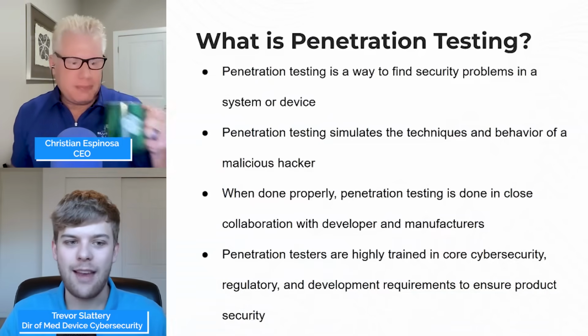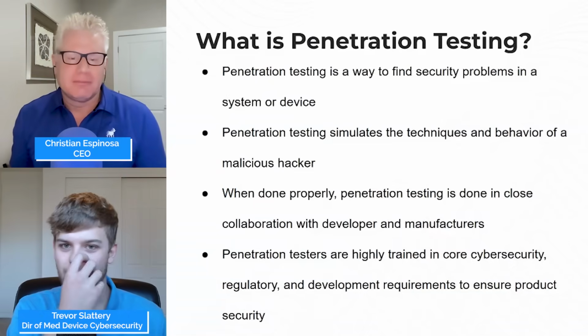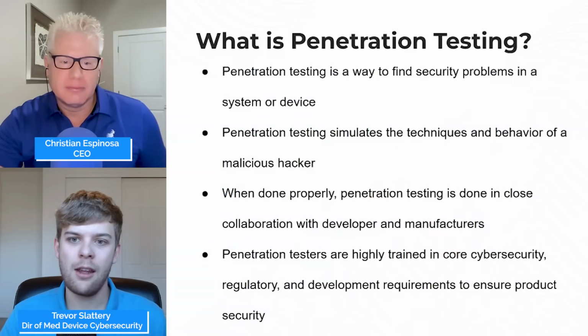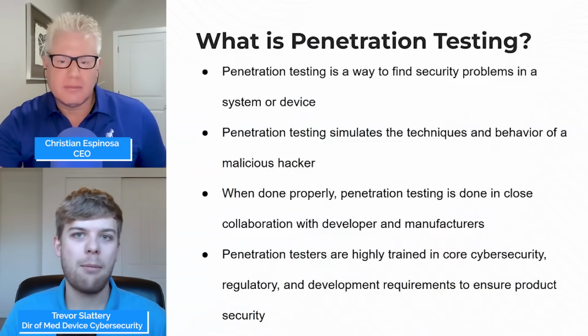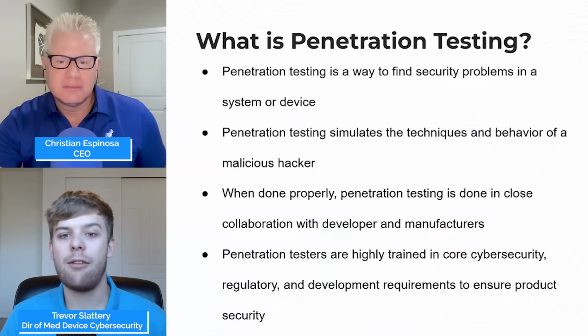There can be a lot of misconceptions around this topic, so I want to clear some of those up. Penetration testing at its core is a way to identify a security problem in a system or a device. We're trying to simulate techniques and behavior of a malicious hacker using the same tools, the same research, the same procedures that they're using so that we can mimic what would happen in an actual environment and more properly be able to prepare for it.